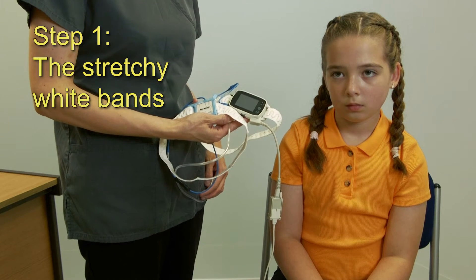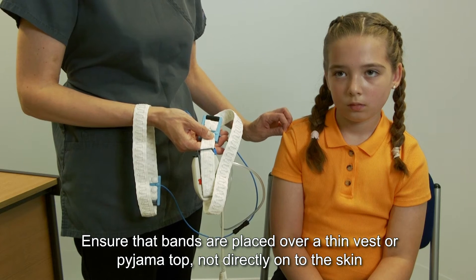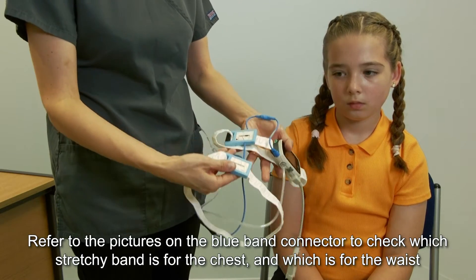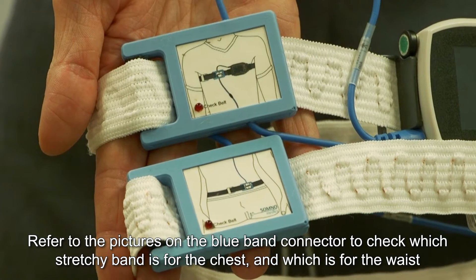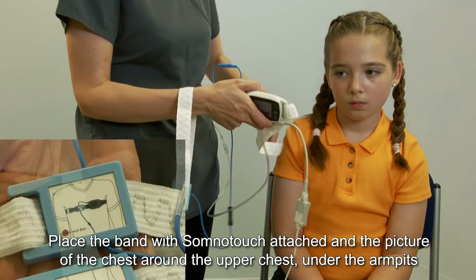Step 1: the stretchy white bands. Ensure the bands are placed over a thin vest or pyjama top, not directly on the skin. Refer to the pictures on the blue band connector to check which stretchy band is for the chest and which is for the waist. Place the band with the SomnoTouch attached and the picture of the chest around the upper chest, under the armpits.